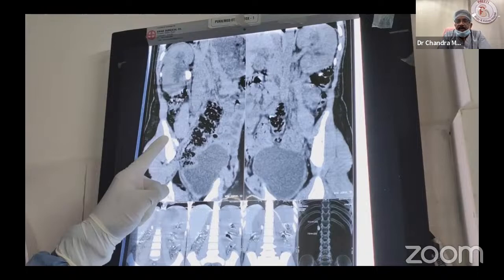The important point I wanted to share here is, if you put the ureteroscope and the ureter is not admitting it, either you have to put the stent and postpone the case for next time for RIRS, or you have to do prone or supine PCNL.